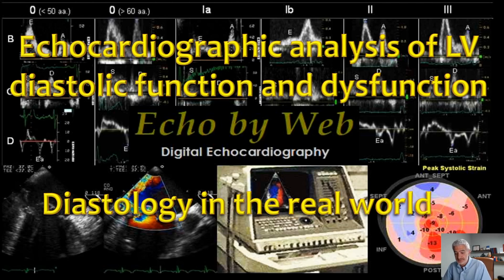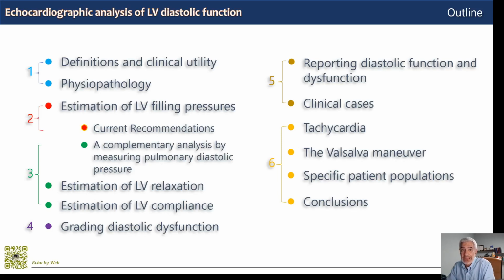This is an outline of the 6 talks on the echocardiographic analysis of left ventricular diastolic function and dysfunction. In the first talk, we will look at definitions of diastolic function, diastology, and the clinical utility of the echocardiographic analysis, and then there will be a basic presentation of the physiopathology of left ventricular diastolic function.